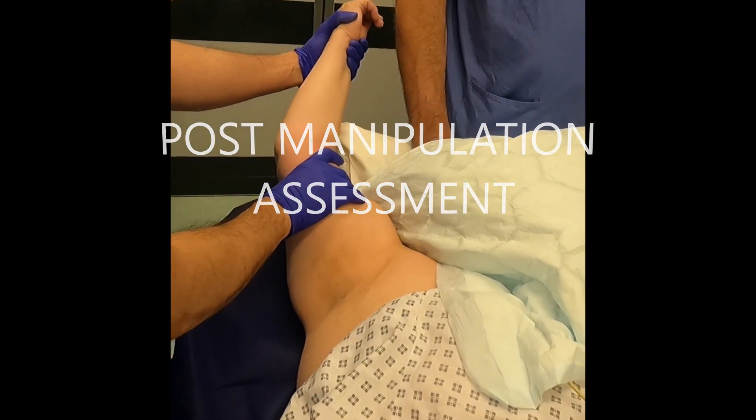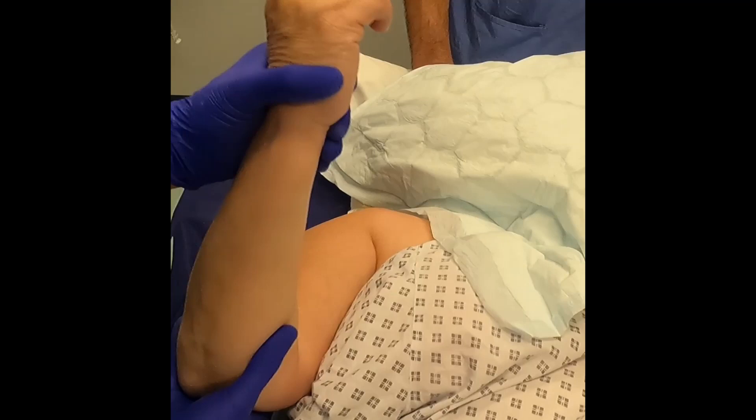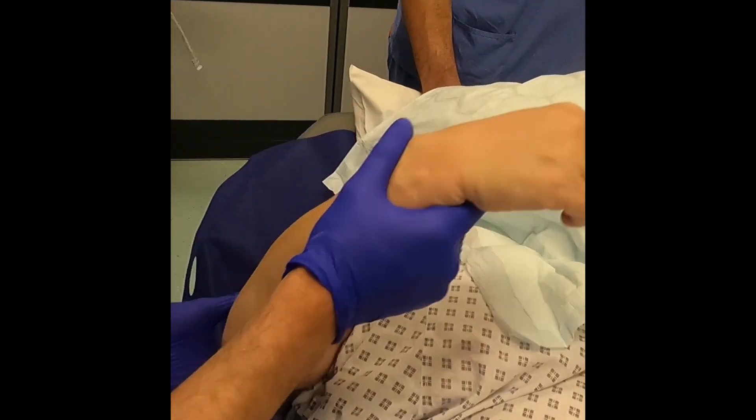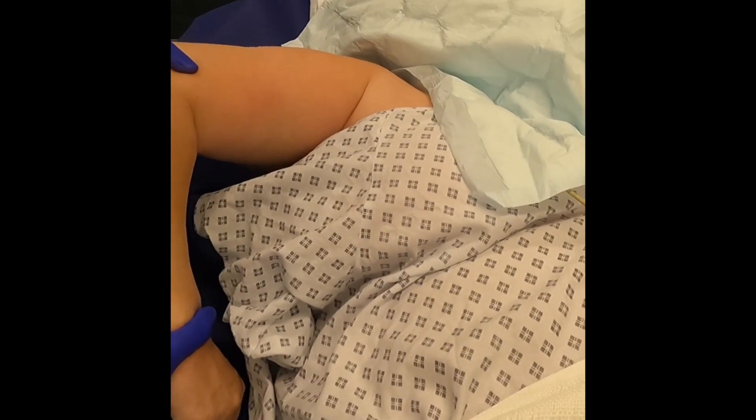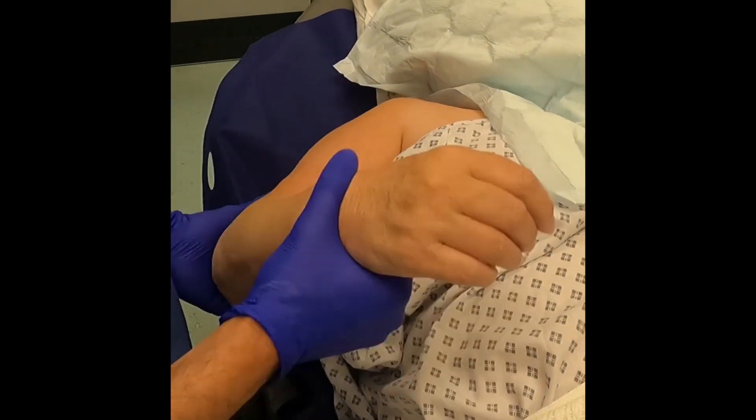The shoulder girdle is then taken through its full range of motion in lift off, external rotation, adduction and abduction, as well as internal rotation, with near normal movements restored.